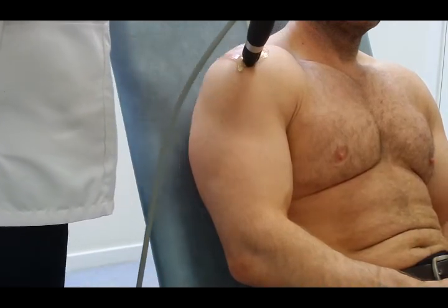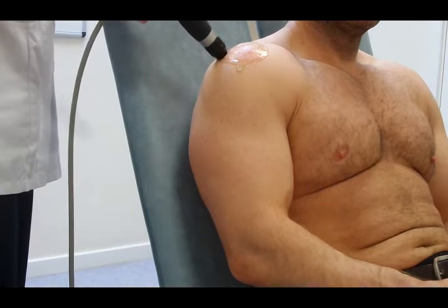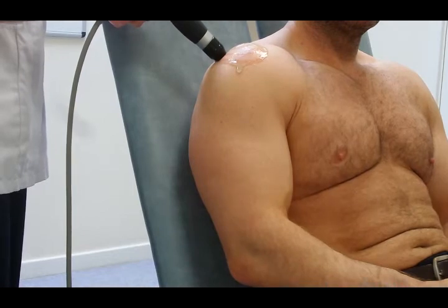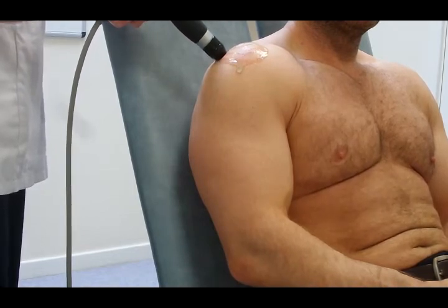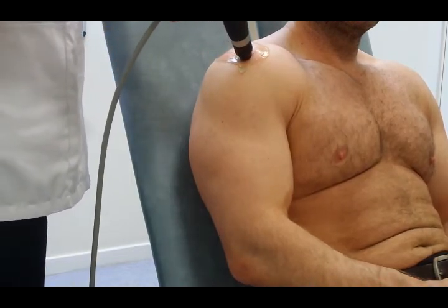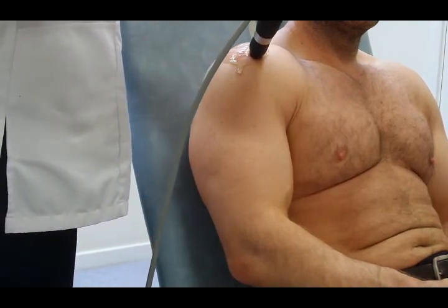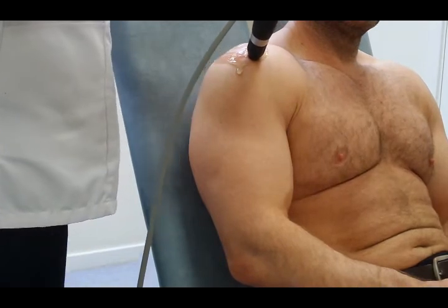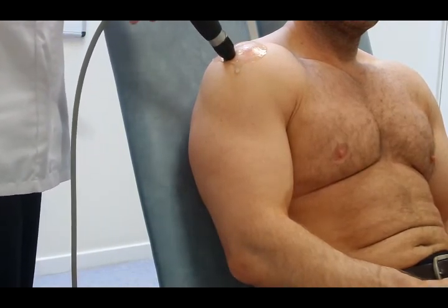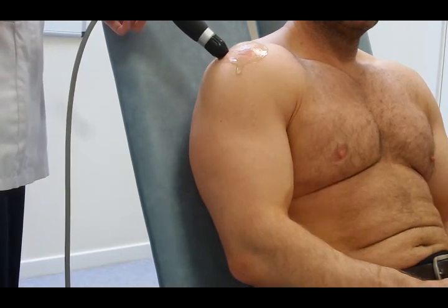If an area is particularly sensitive, you might find that if you do more than 200 shocks, the patient may not be able to tolerate the pain. If that's the case, move off the area, come back again, and do another 200 shocks on the area. Just keep working backwards and forwards across the tendon until the 2,000 shocks are reached.